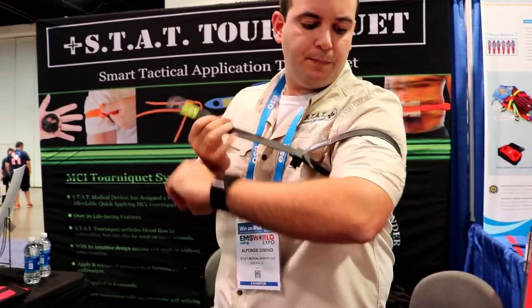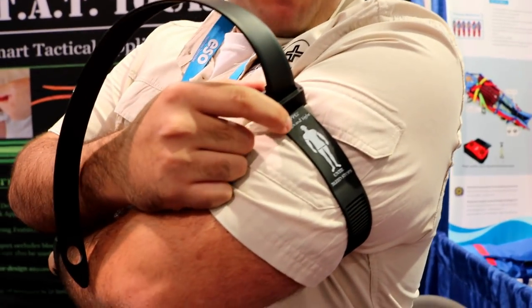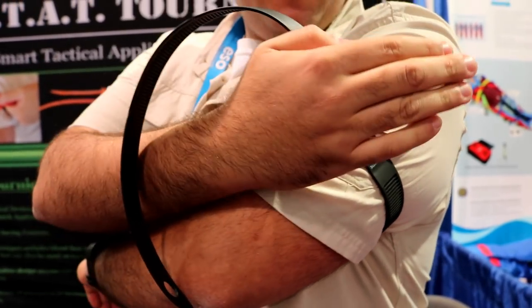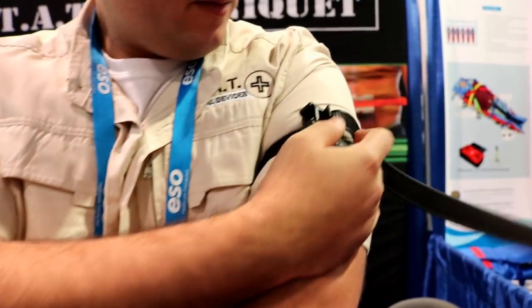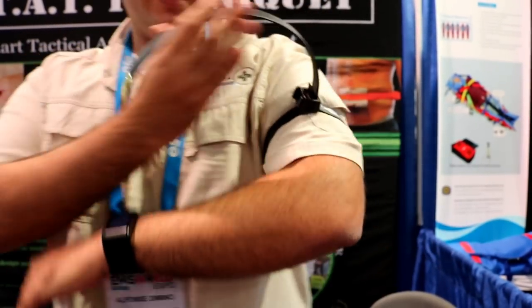If you're going to do a self-application, all you have to do is follow the body instructions, which you see here: apply high and tight until bleed stops with markers. Keep that on the outside of your body. This right here is a release lever — all you have to do is pull towards your heart to get maximum leverage.